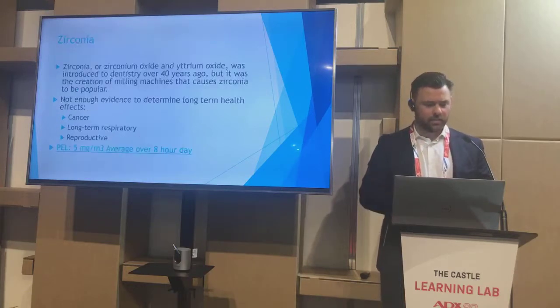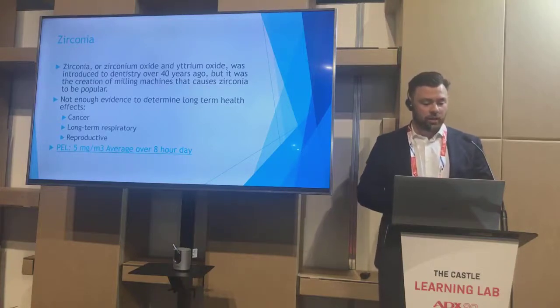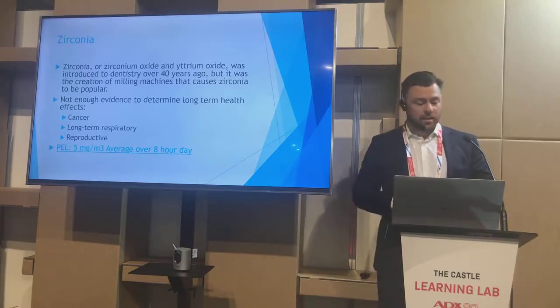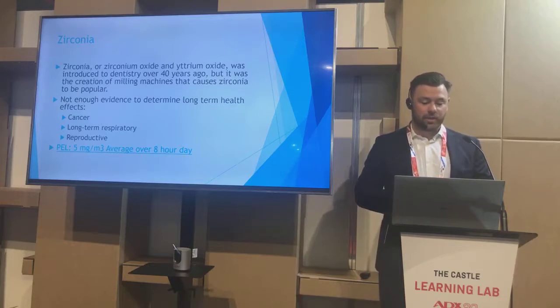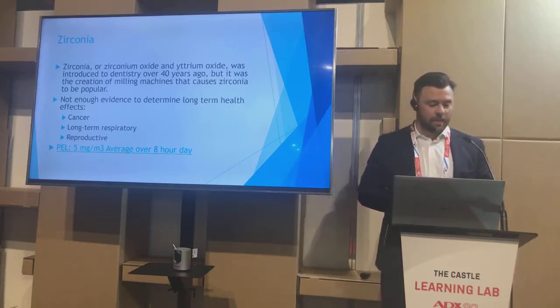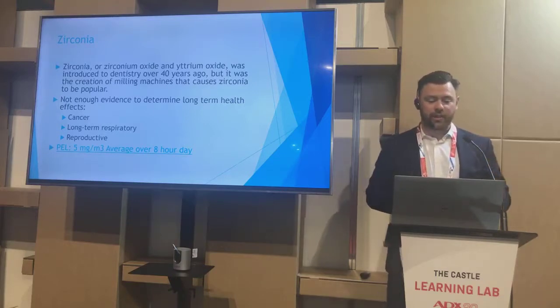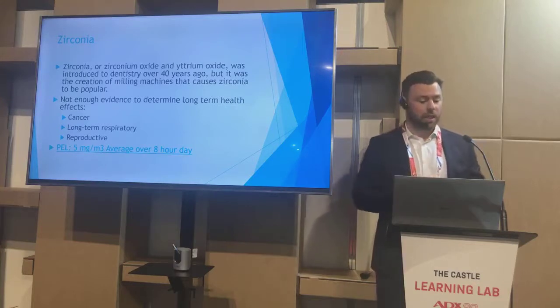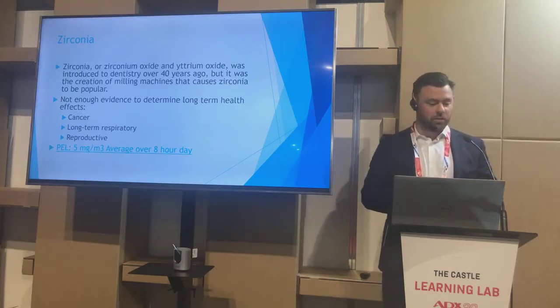The next material I'd like to talk about is zirconia. Zirconia, or zirconium oxide and yttrium oxide, was introduced in dentistry over 40 years ago. It didn't become popular until milling machines started coming out into the space. Right now, there's not enough evidence to determine the long-term effects of zirconia dust on your body. No signs indicate cancer, long-term respiratory issues, or reproductive issues.